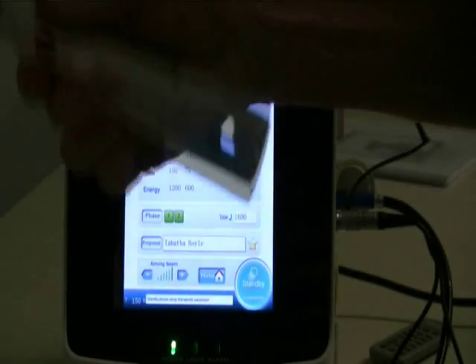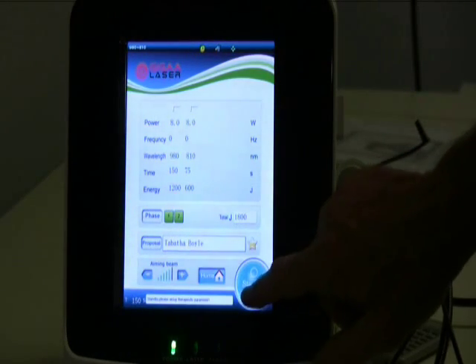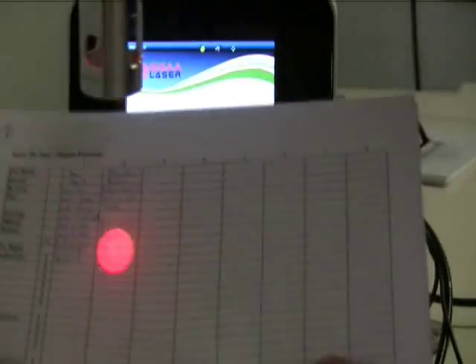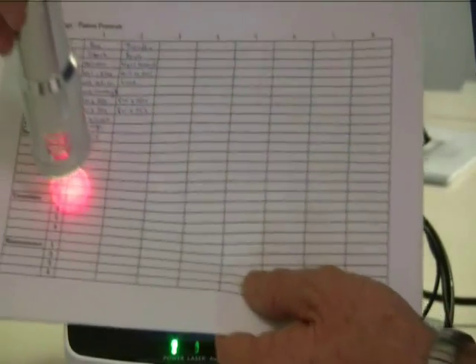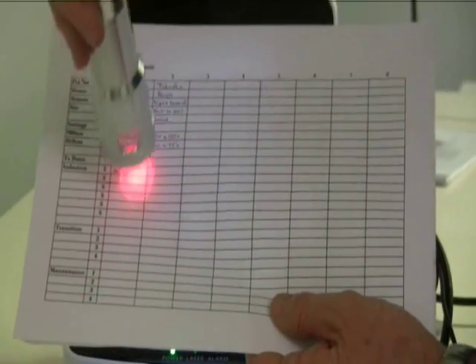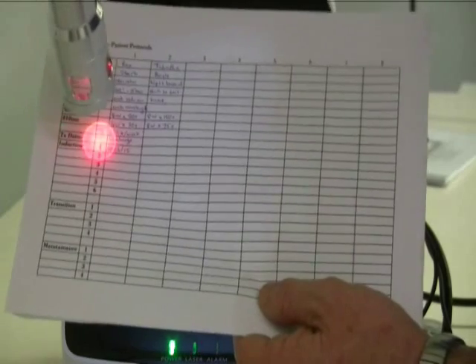We have the handpiece in our hand, we press the standby button down the bottom here, that one, and it'll go yellow. The aiming beam will come on, you can see that there, and we treat her back by moving the handpiece up and down. If this is her head up this end and her tail this end, she's obviously at a bit of an odd angle.